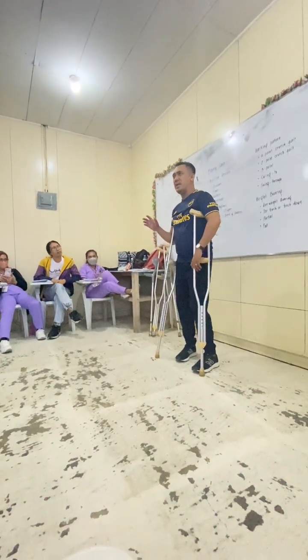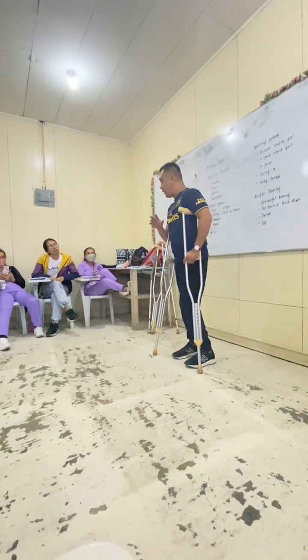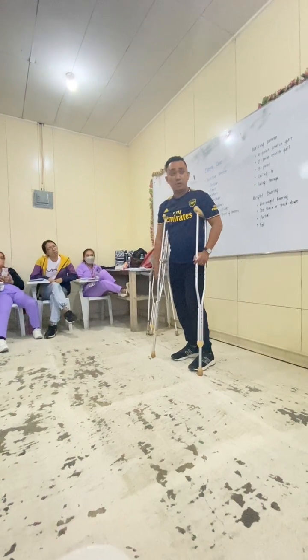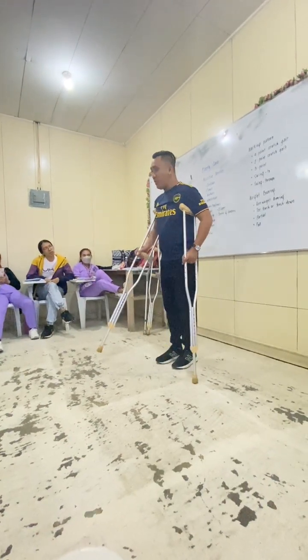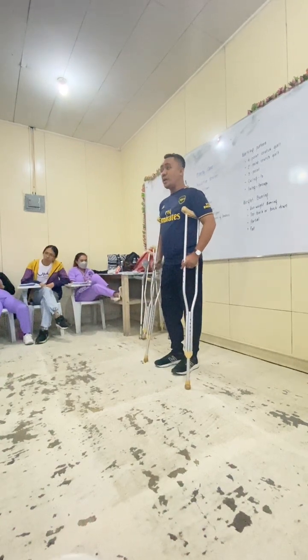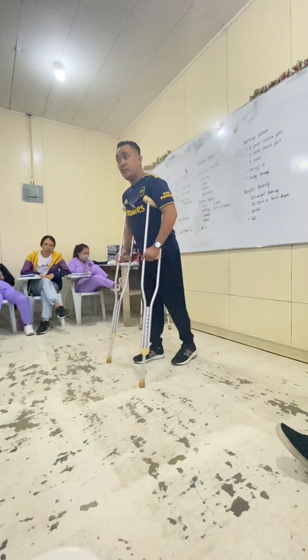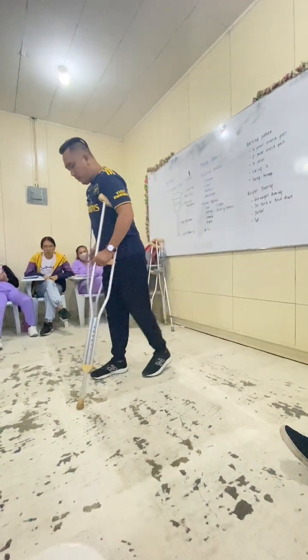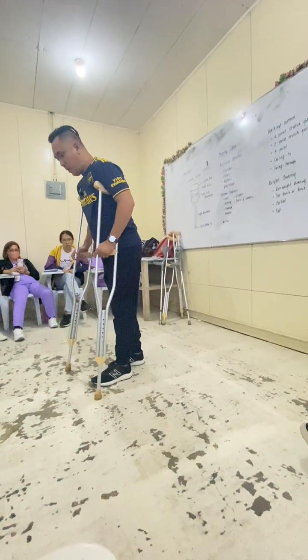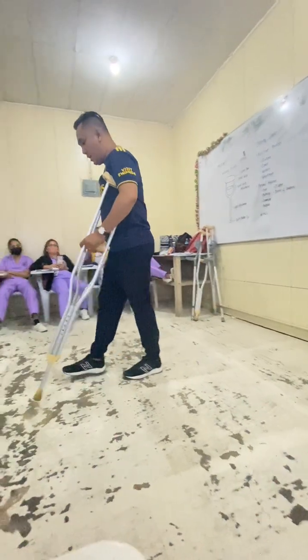But the problem is that it's really difficult to learn. Medyo libog gamay si 2-point. Together. Pero malipat ko sa si patient when using it. Mas okay man ang 4-point, hindi man malibog si patient. 1, 2, 3, 4. Pero kung 2-point eh, masabay kayo.